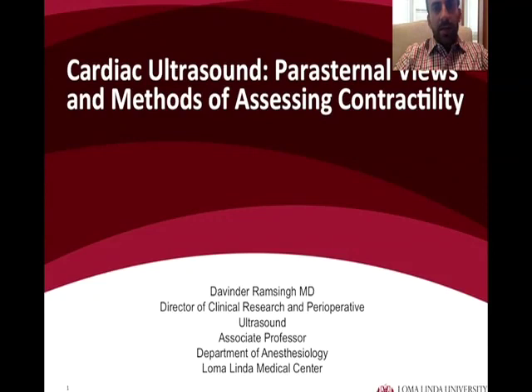The topic that we will discuss today is cardiac ultrasound with a particular focus on the parasternal windows. We'll highlight the different windows throughout these modules that we use to insonate the heart and the benefits of each one of those windows. But today we'll focus for the most part on the parasternal windows and how they can give us an appropriate view of the ventricles to allow us to assess systolic function and overall contractility.